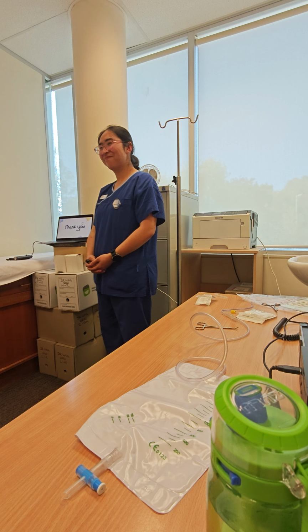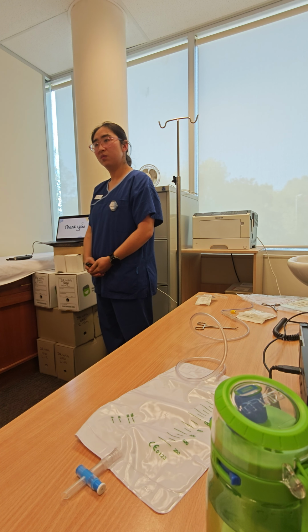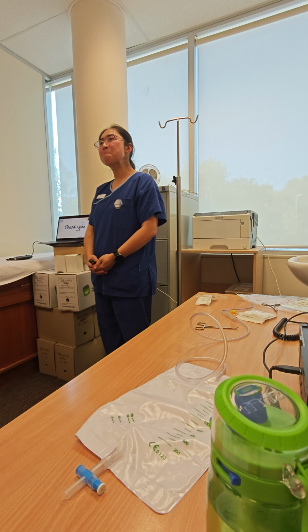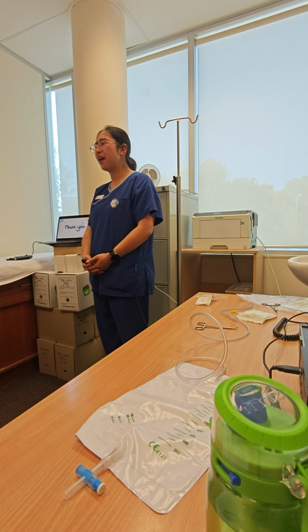Thank you. I have one question too. What is the biggest risk for this procedure, and is there any post-procedural care for the patient? The biggest risk for the patient doing the procedure? If they haven't had any contrast dye before, they might have an allergy.